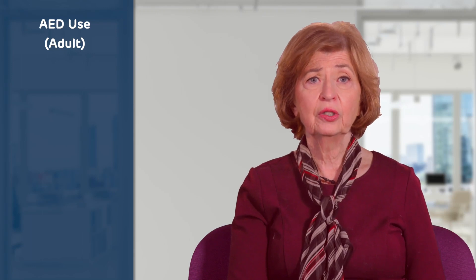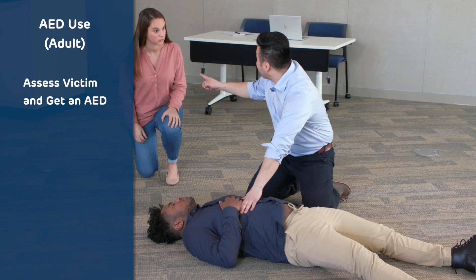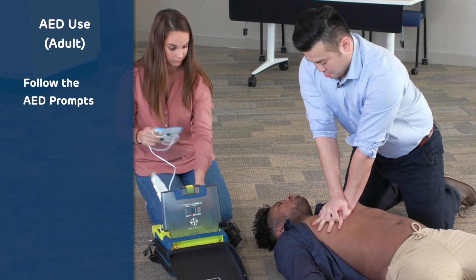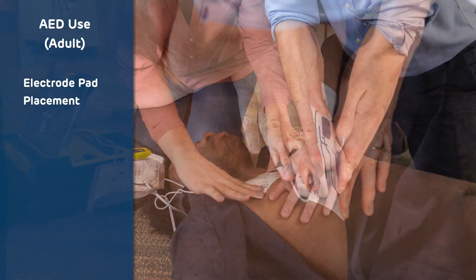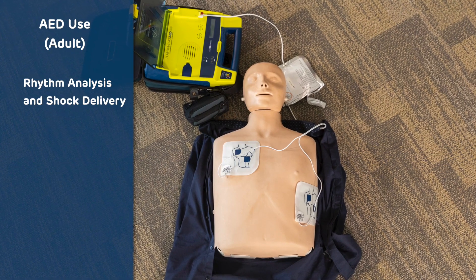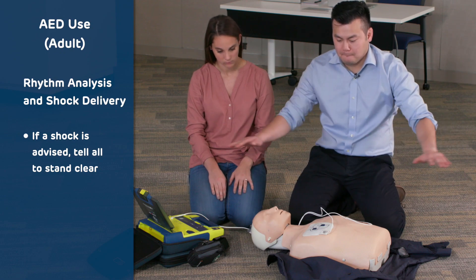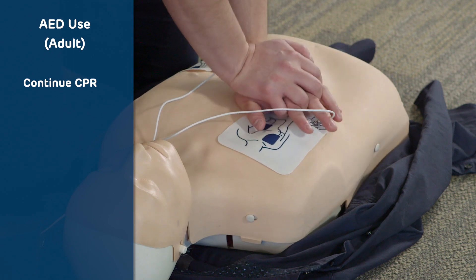Let's review the steps of using an AED. First, assess the victim and get an AED. Next, follow the AED prompts — tear open the package and remove pads. Place the electrode pads on the upper right chest and on the lower left chest. Allow the AED to analyze the rhythm and advise shock delivery or not. If shock is advised, tell all to stand clear. Continue CPR whether shock is delivered or not.